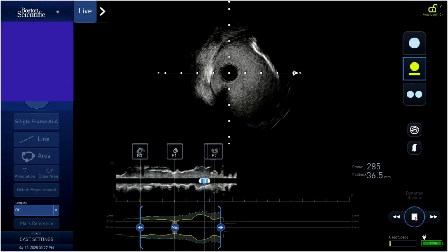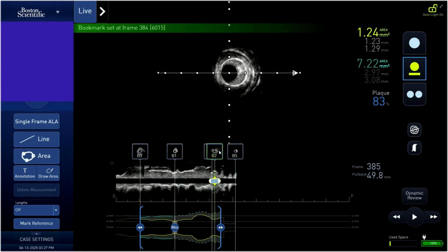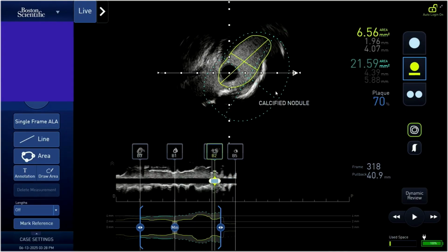Now we come to the left main bifurcation. Here's some eccentric nodule, but I show you the tightest left main. But the left main is not tight, right? Eccentric region, but area-wise it's 6.5. It's more than the cutoff. And what about the LAD?